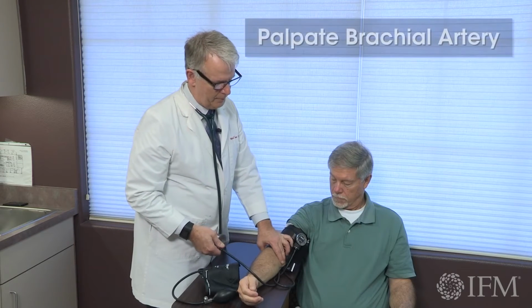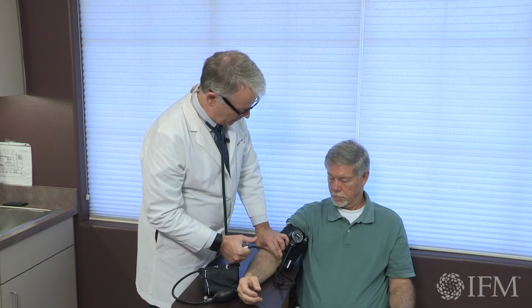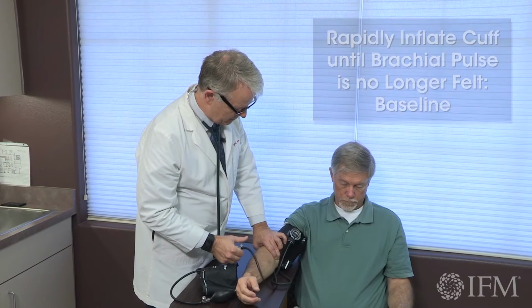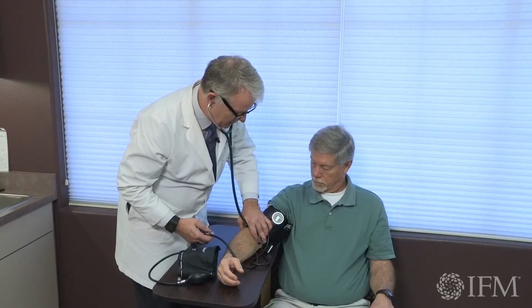When you first palpate the brachial artery, which is right there by the head of the biceps, you want to determine when the pulse extinguishes with insufflation of the cuff. That gives you a rough idea of what his blood pressure is. And then you are going to insufflate the cuff 20 points above that line when you begin to listen with your stethoscope, using the bell of your stethoscope. Why do you do that? You do that so you can hear the 5 different Korotkoff sounds.